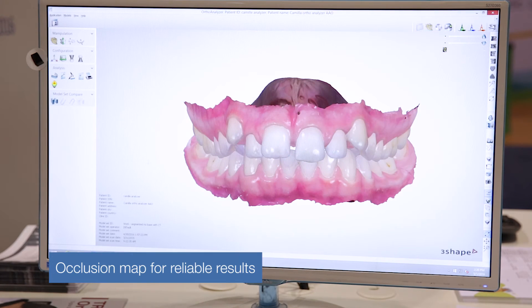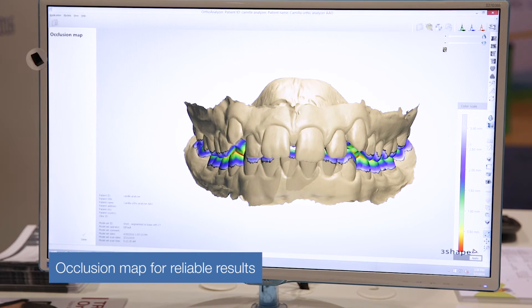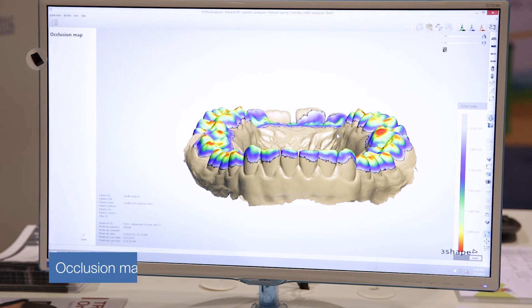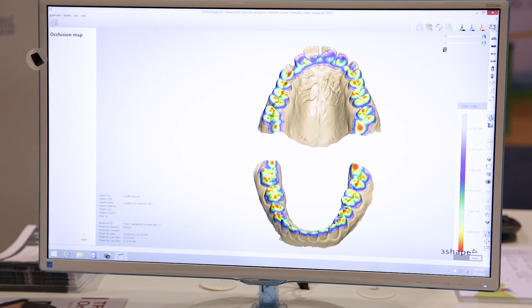You can also easily create an occlusion map. Based on the color scale — I'll now change to an open bite — you will see how the occlusion works between the maxilla and the antagonist down here.